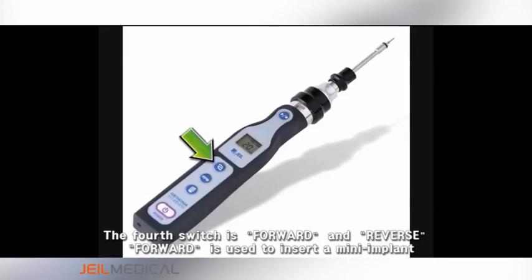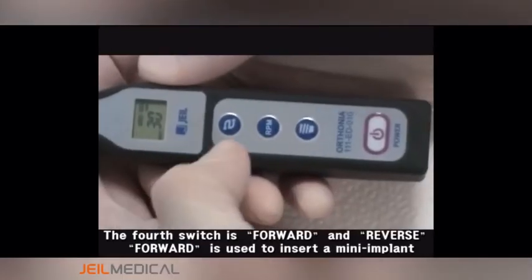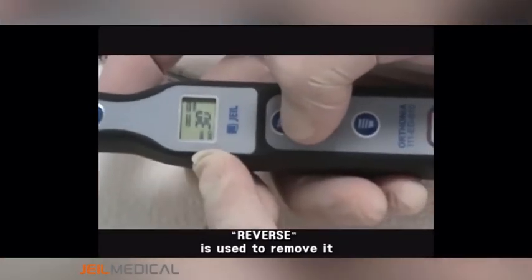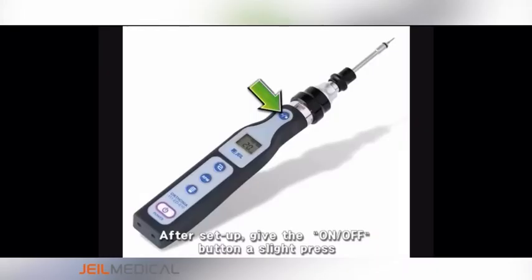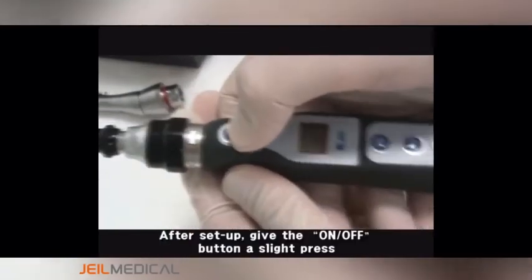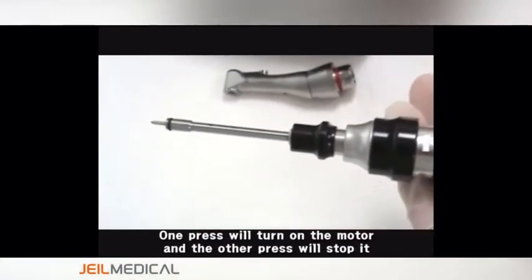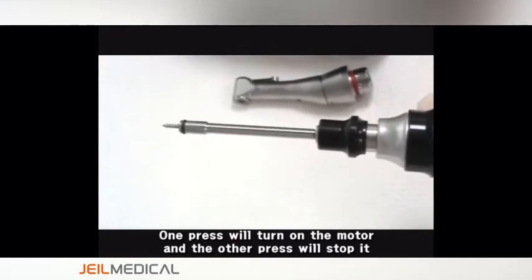The fourth switch is forward and reverse. Forward is used to insert a mini implant; reverse is used to remove it. After setup, give the ON-OFF button a slight press. One press will turn on the motor and the other press will stop it.